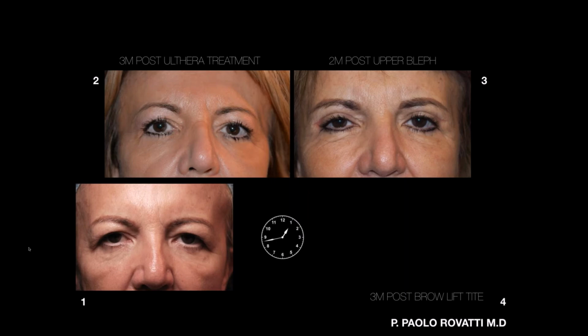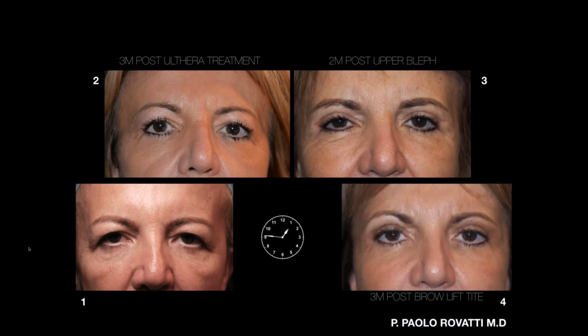So what I did after, we did AccuTite on the brow, and after 3 months, an elevation of the brow lift of the arch. So I think it's not perfect, but if you can see on the left side, the result now is better. So we lose one year, but we understand exactly what the management of the brow is.